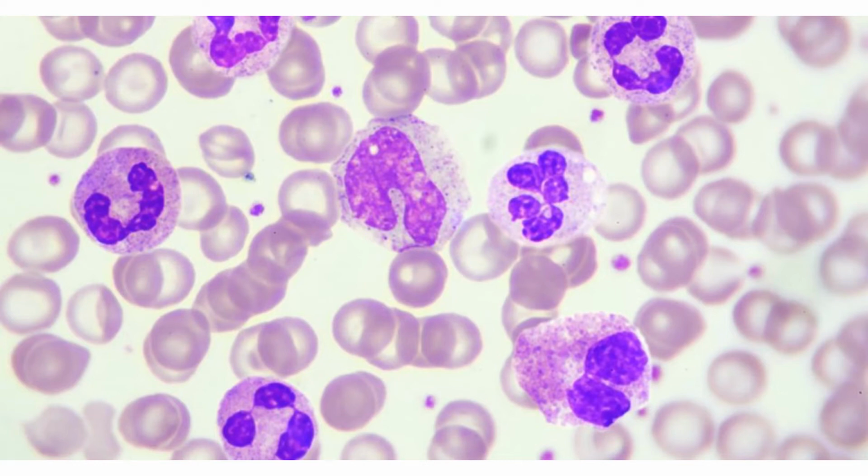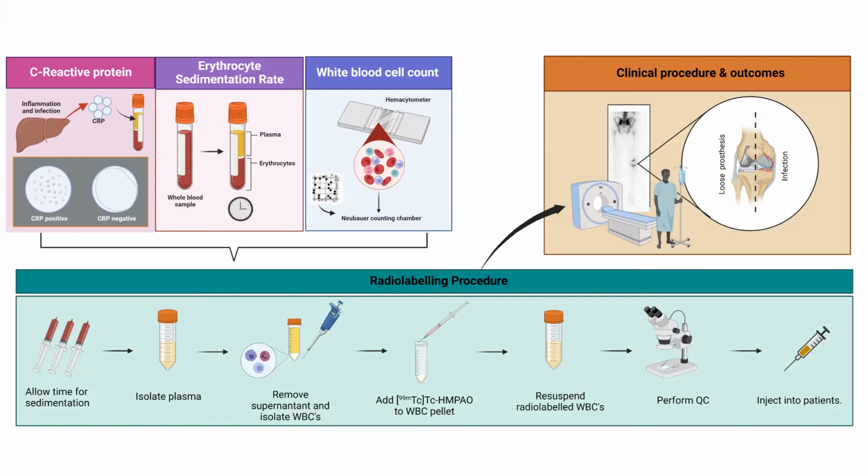In today's nuclear medicine snack, we are going to look at the wild and wonderful world of white blood cells. In nuclear medicine, we can tag the white blood cell with radioactivity and then monitor how they spread in the body and chemotaxis present, and that is a way of monitoring infection and maybe some inflammation.